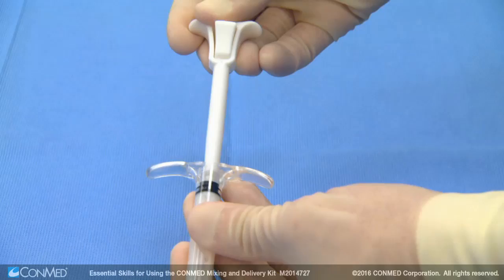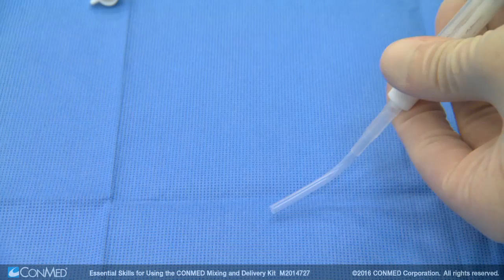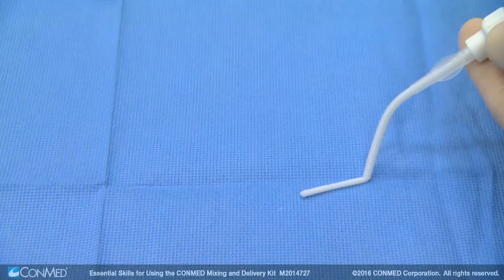Remove the lure cap and attach either the long lure cannula or short curved cannula to dispense the mixed material. An obturator can be used to deliver any material that remains in the cannula.